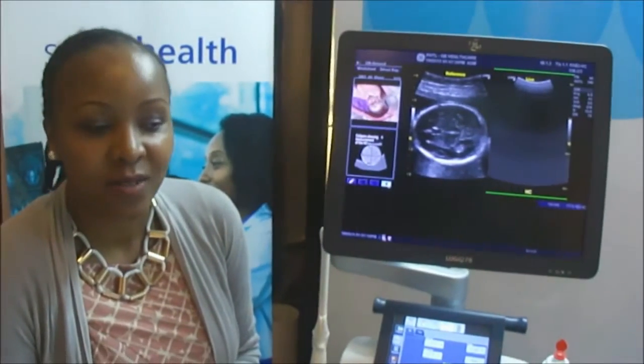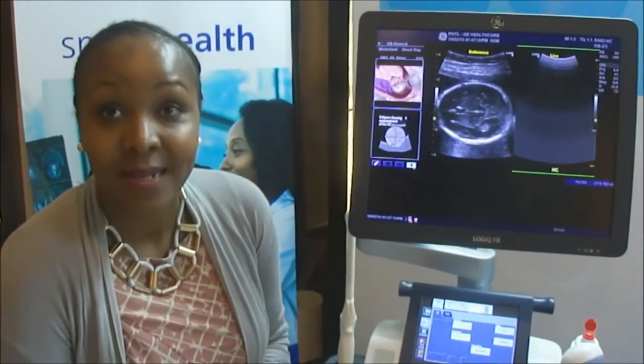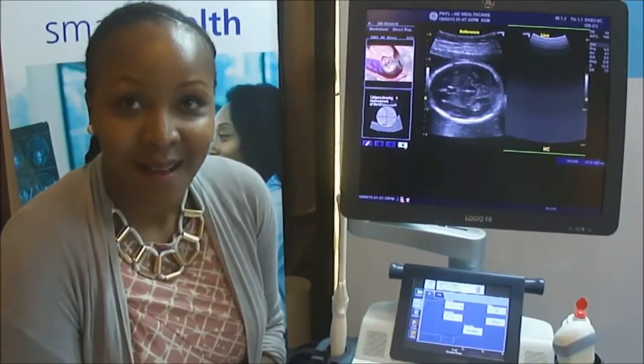As you know, GE was fortunate enough to get the tender to supply radiology equipment. This is one of the machines that will be going to the counties — it's an ultrasound system, a Logic F8.